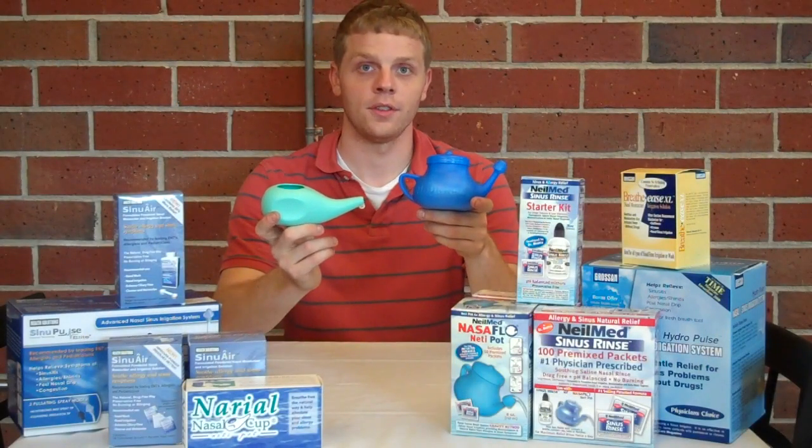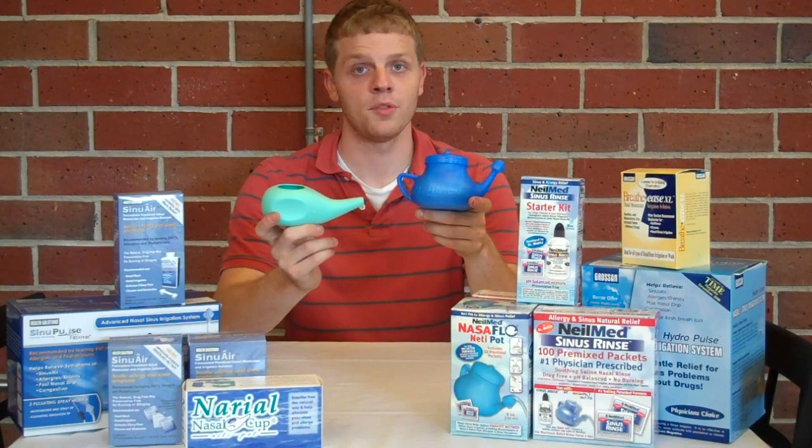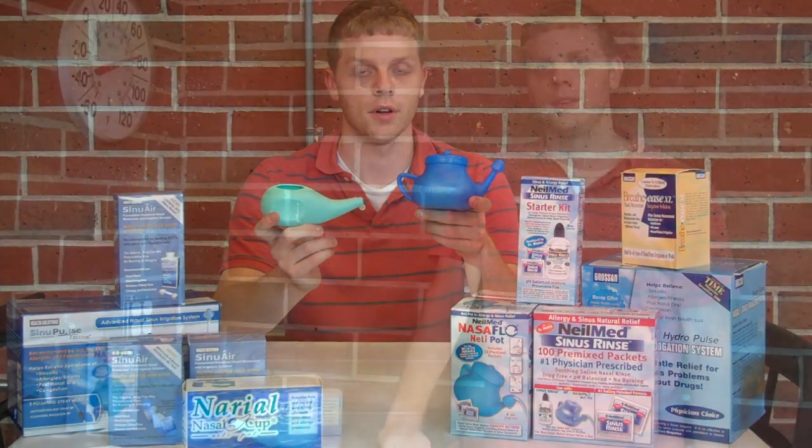Rinsing or flushing your sinuses is an excellent alternative to prescription medication or over-the-counter drugs. The solution washes away allergens like pollen, soothes dry or inflamed sinuses, and moisturizes dry nasal passages.